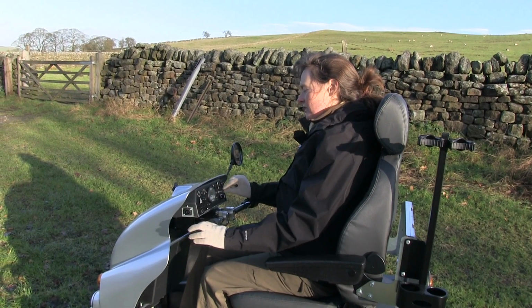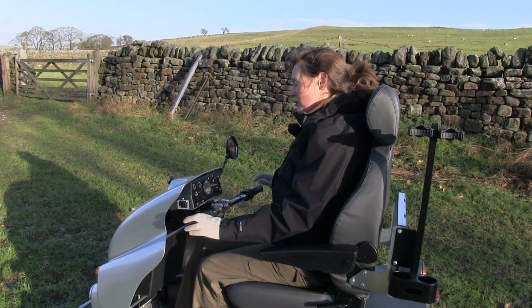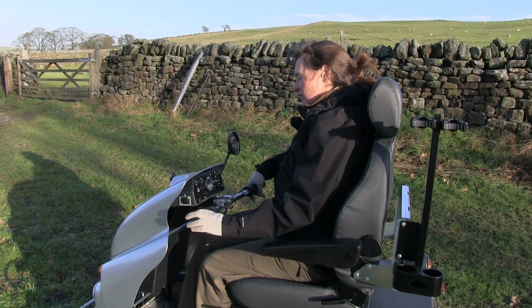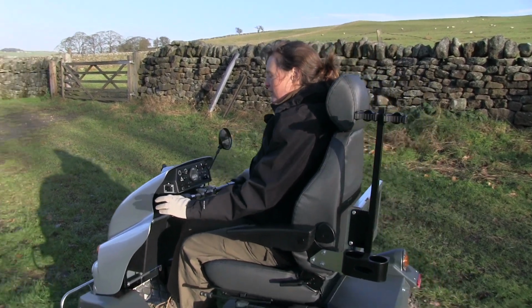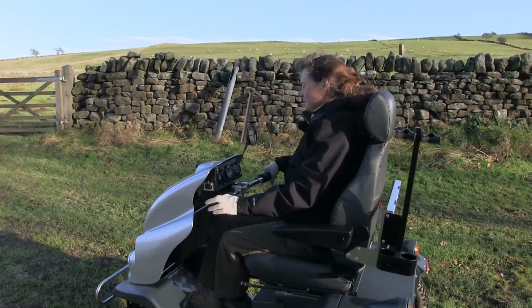At that point, making sure that you've got the Tramper going forward and that you've got it in tortoise, you twist the grip and you can move forward. And then to stop, you simply let go.